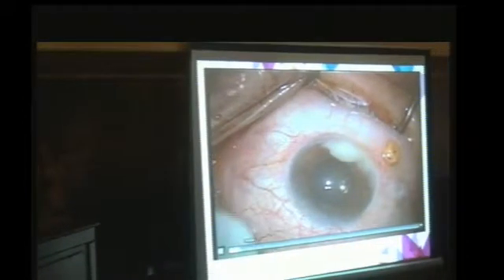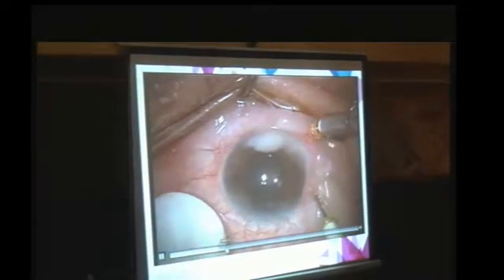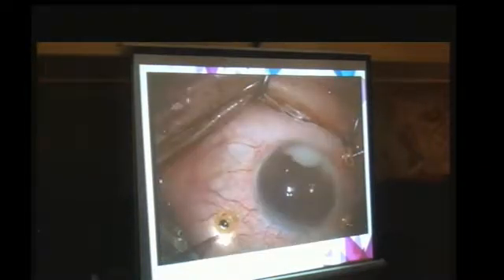Here is a pseudophakic case with hypopyon present. Insertion of the trocar cannula system. At the beginning, of course, the view is very hazy. I started the vitrectomy upper nasal until I see part of the retina or retinal blood vessels, then I go more posterior. With time the view gets clearer, and you can notice here that about the end of the surgery we have an almost normal view. We left the case on air.